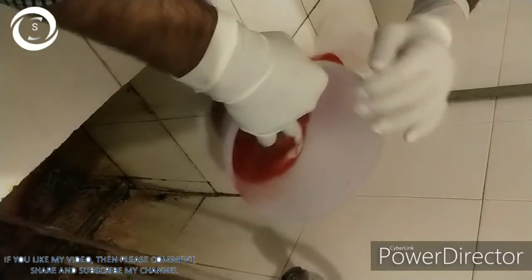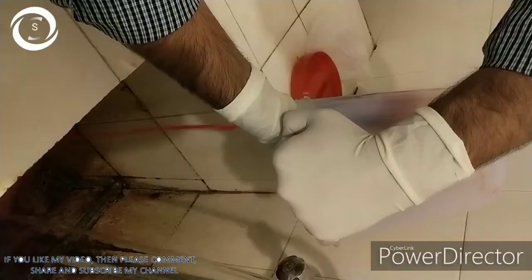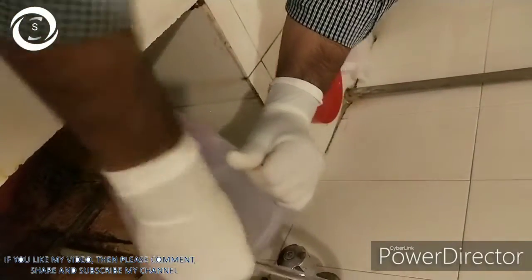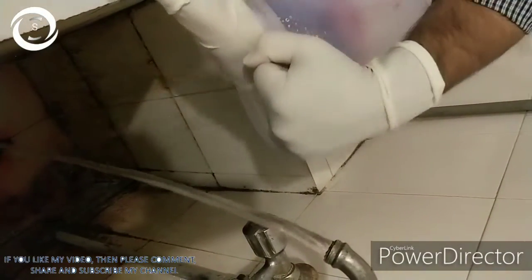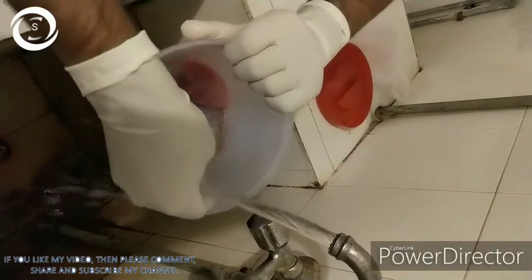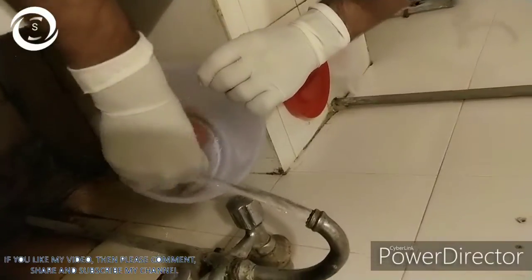As soon as placenta is delivered, it should be brought to the eye operation theatre. Now open the jar, remove all the blood, and thoroughly wash the placenta containing amniotic membrane with tap water. During this process the amniotic membrane will become loose to the underlying chorion.